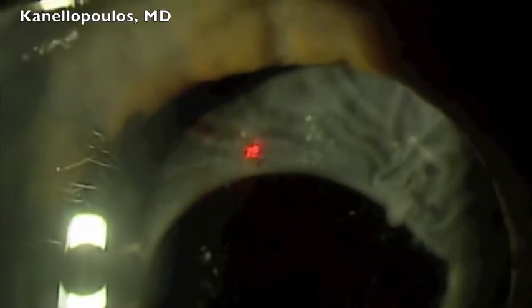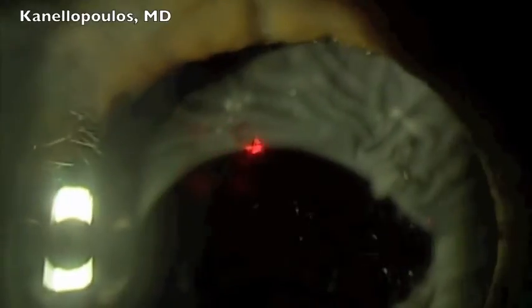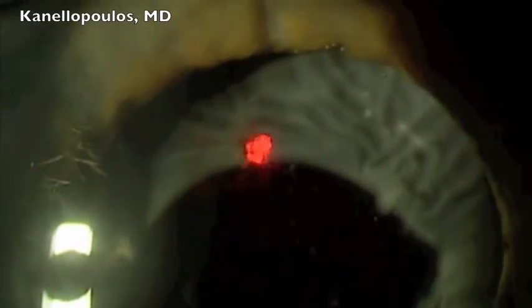Pleased to share with you this interesting video. This is a pseudophakic patient, a young 35-year-old lady, who had a phakic intraocular lens gone wrong. She also has a DSAEK graft done two years ago, and we did a posterior YAG capsulotomy a year ago in the same eye. Please note the significant fibrosis of the anterior capsule and the phimosis — the capsule opening has narrowed down on the vertical meridian to about 4 millimeters.